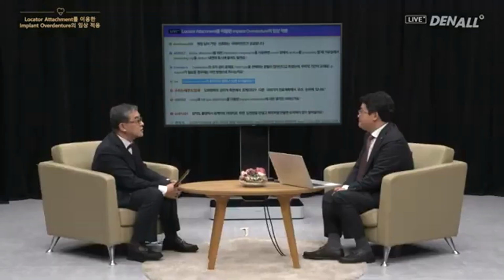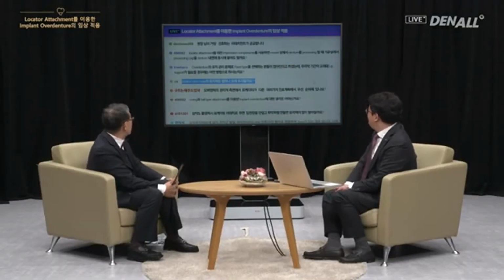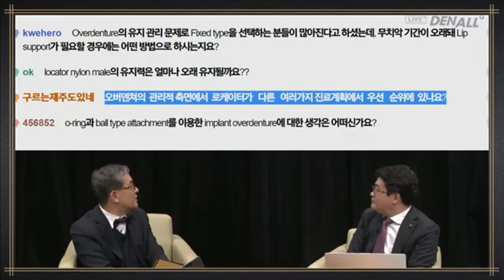If we don't say anything and a year later, if we ask for repair cost, the patient is going to complain in a lot of cases. You need to inform the patient of what is going to be done and what is necessary over the course of the year and every 6 months thereafter. If you inform the patient of this information ahead, then you'd be able to avoid much confrontation with your patients.